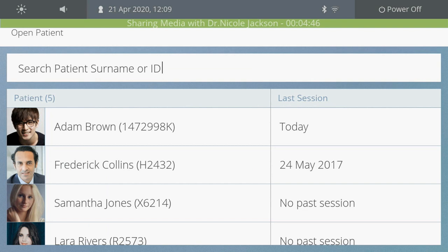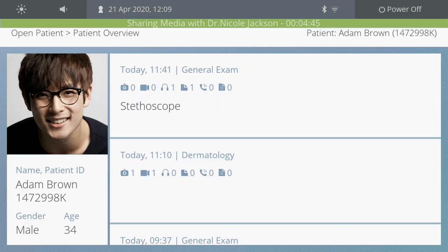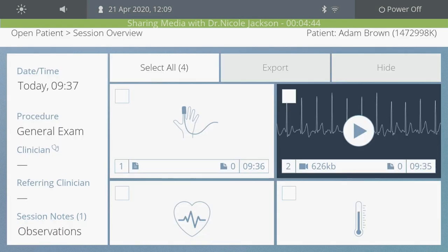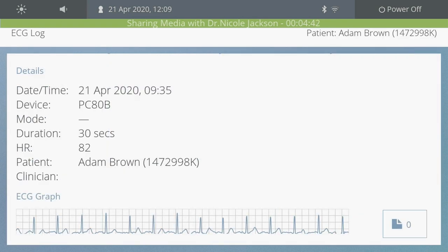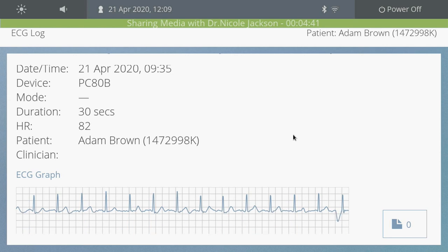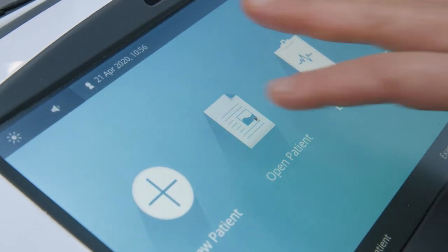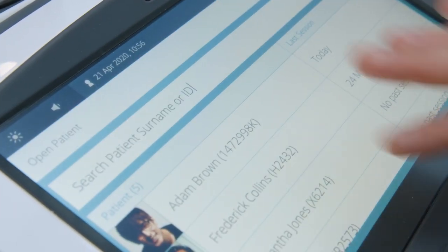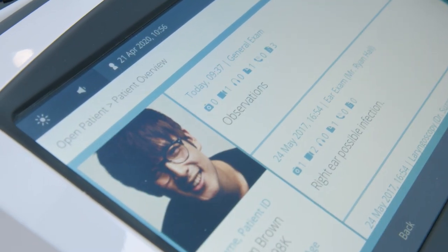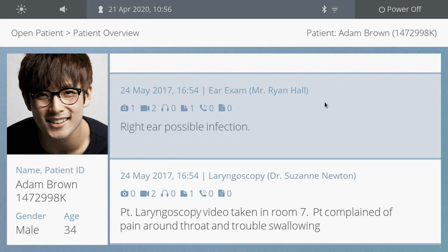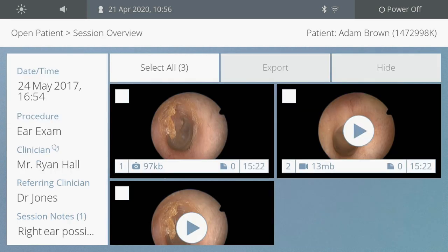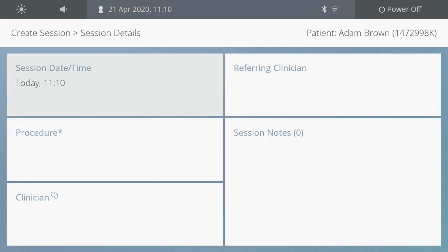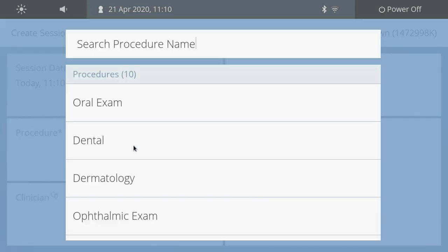Images and data are stored in the encrypted patient database, which is designed to exceed the toughest privacy requirements. Appointments or sessions are saved for each visit to help manage patient data, and a new session is created under the patient record on each visit.